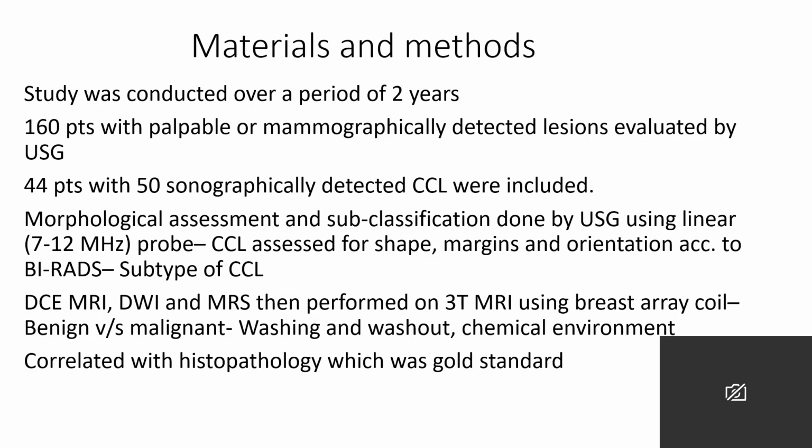Materials and methods. The study was conducted over a period of 2 years. 160 patients with palpable or mammographically detected lesions were evaluated by ultrasound, and 44 patients of 50 sonographically detected complex cystic lesions were included. Morphological assessment and subclassification was done by ultrasound using a linear probe.